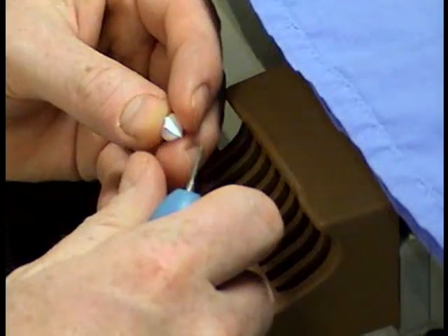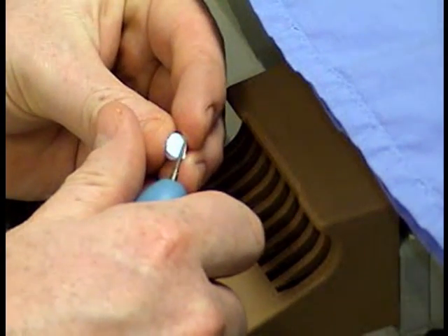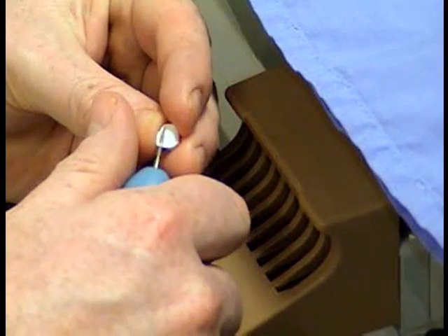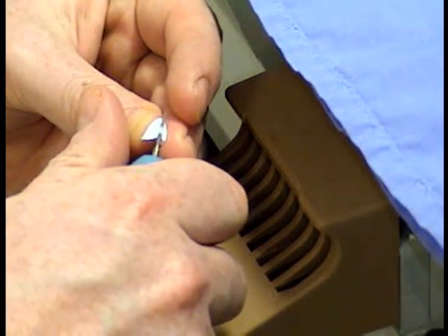The next thing is to take a diamond burr and reduce the collar from around the margin area. As mentioned in the last demonstration, you can do it on the machine or by hand. We like to go belt and braces — make sure we get a nice marginal fit, then take the excess back with the diamond burr. It's a very soft material.